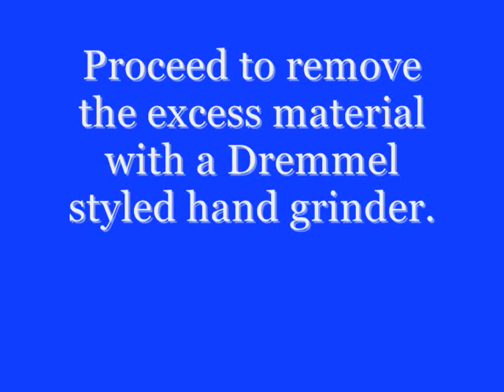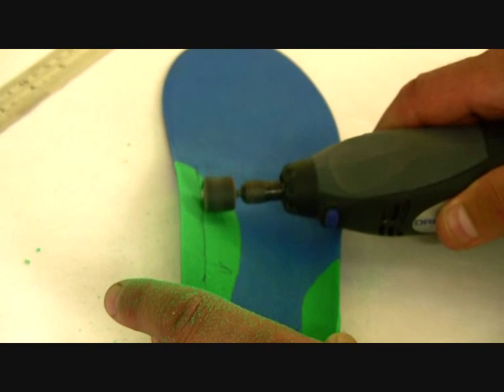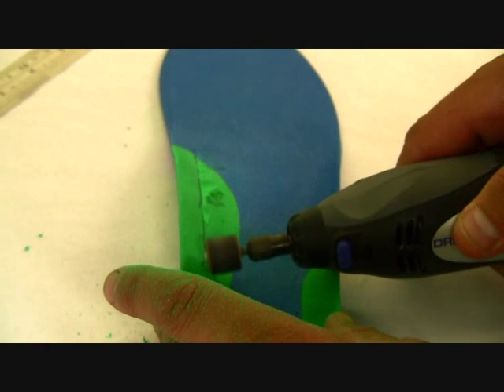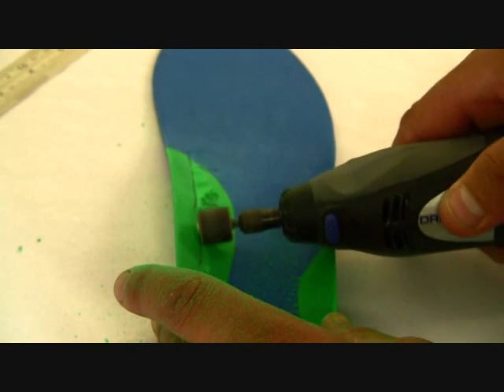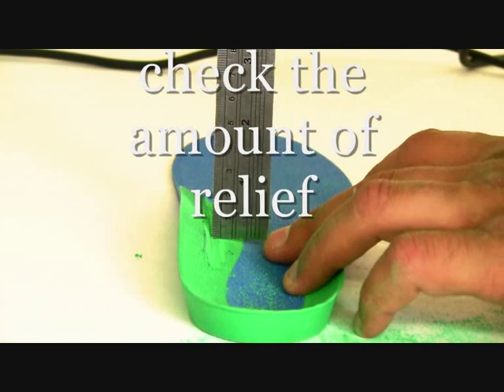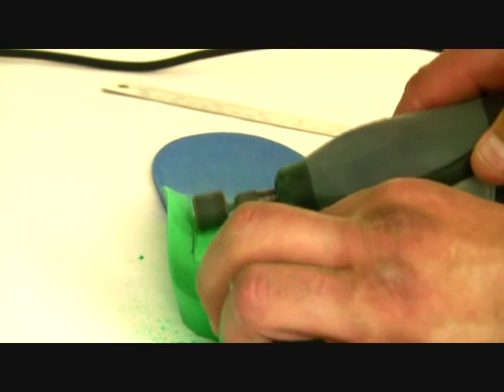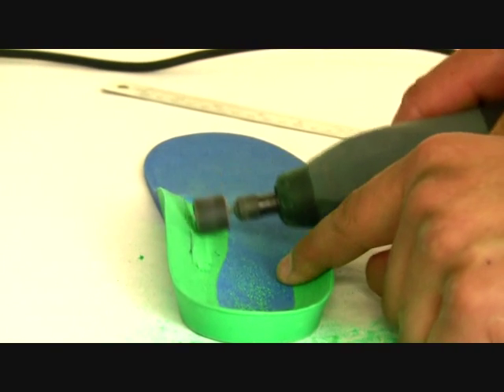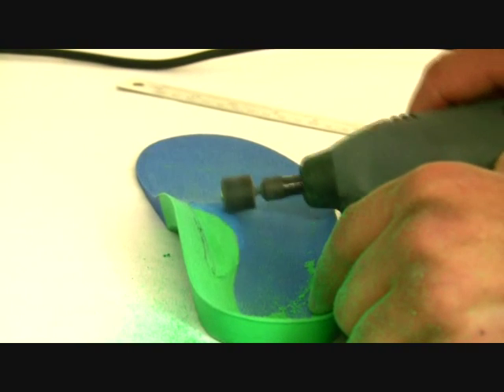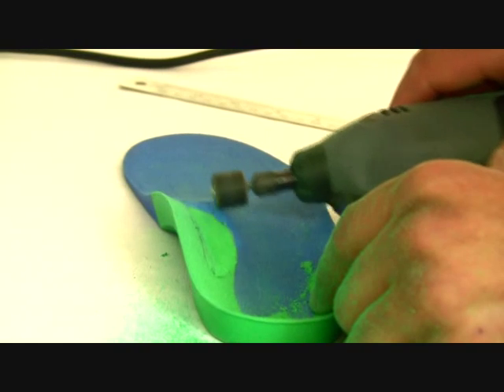You can use a simple Dremel-styled hand grinder to remove the material. The technician is concentrating on the highest part of the arch and removing that material. He is now checking the depth to ensure that he doesn't remove more than that which is required. Continue removing the material and checking the depth.